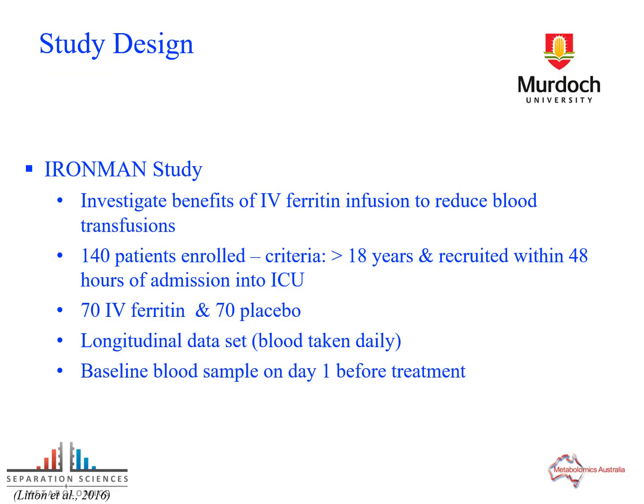Now, the clinician from intensive care came to talk to us about doing a study where they wanted to measure hepcidin as a potential part of a panel of biomarkers for monitoring health within the intensive care unit. So what they did is they designed a study called the Ironman study and investigated the benefits of IV ferritin infusion to reduce blood transfusions.